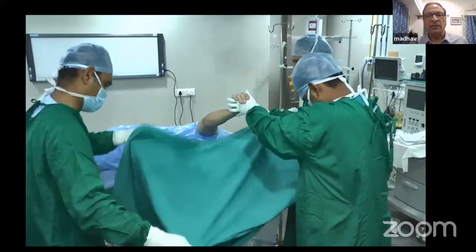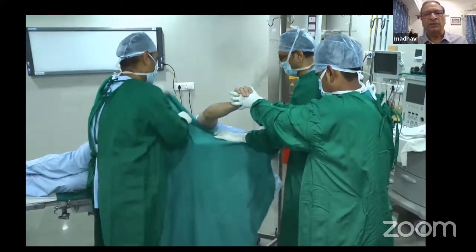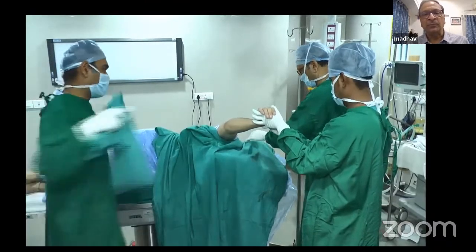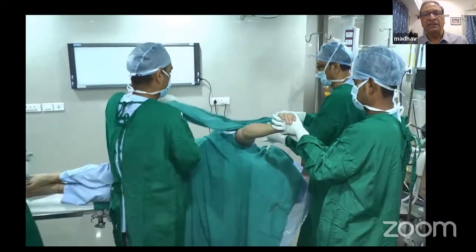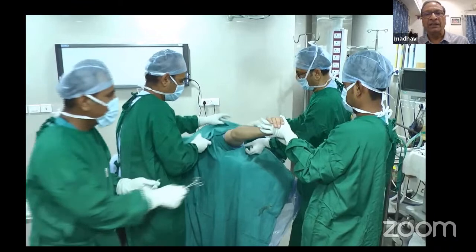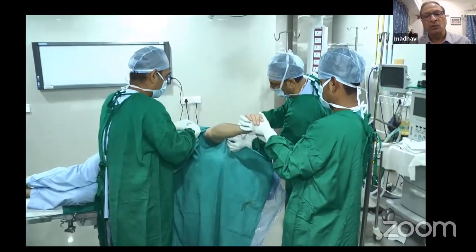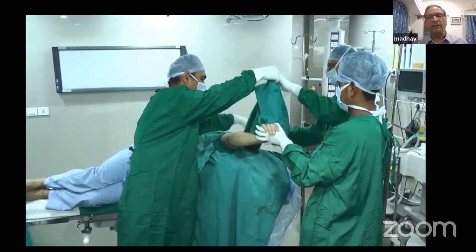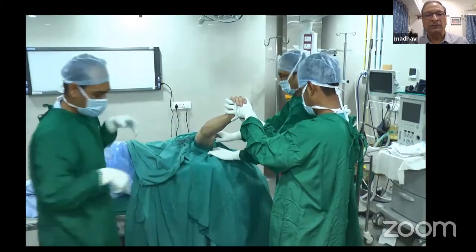Now comes the first cloth sheet. It's a big sheet which covers the armrest and goes right up to the tourniquet, over the head and the chest. The second sheet is unfolded and allowed to drop on the other side, and then the two sheets are secured, one in the axilla and one just above the shoulder or above the arm, just below the tourniquet, with two towel clips. Again, take precaution that you don't puncture the tourniquet, otherwise you will have a tough time while operating.